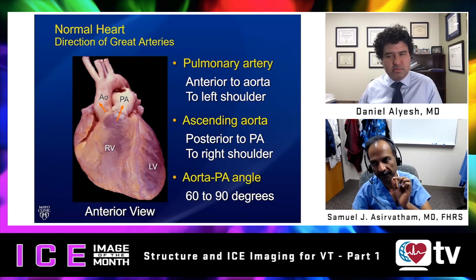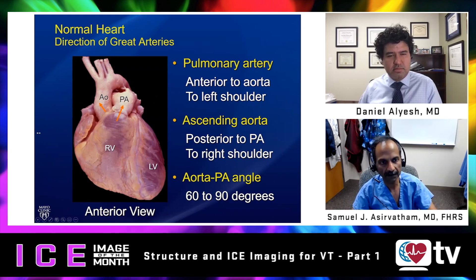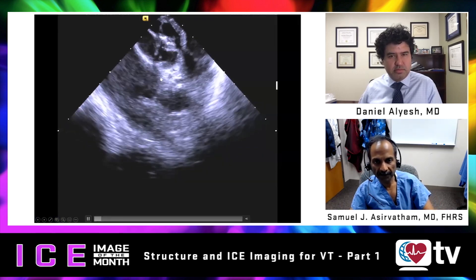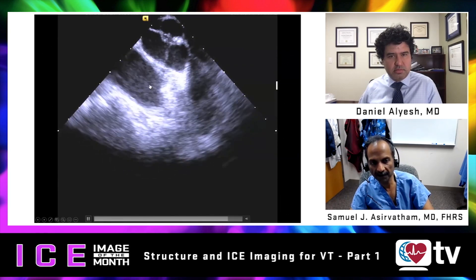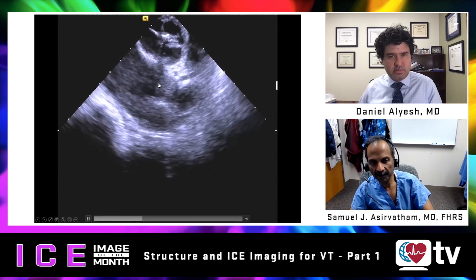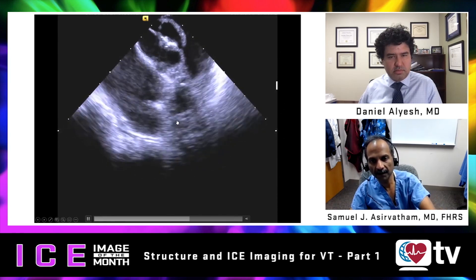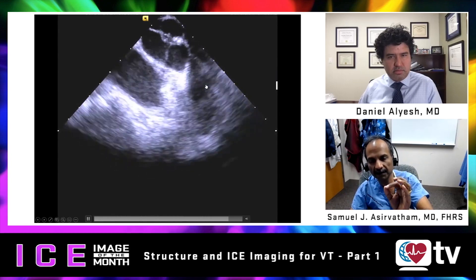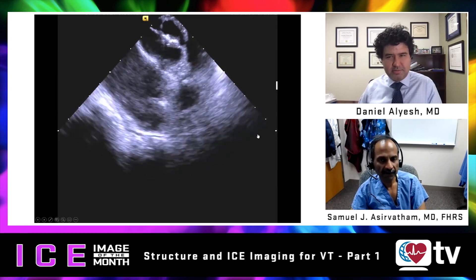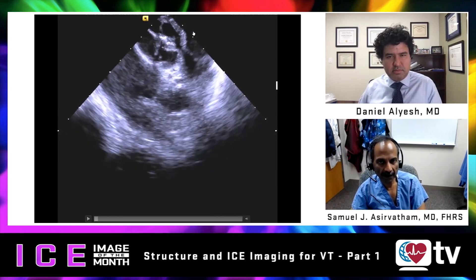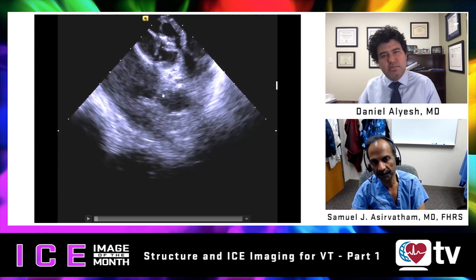For exact ablation, you'll have to pick your best spot and judge the actual distance with the left atrial appendage as a reference. Looking further posteriorly, you can see the left atrium, vein of Marshall ridge, and following it out, the appendage tip comes anterior to the pulmonary outflow. For similar reasons, mapping in the pulmonary outflow itself can sometimes be used to map the epicardial surface of the left atrium.